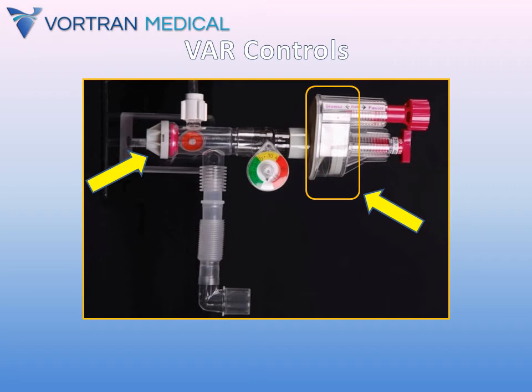Should you doubt the benefits of PEEP, take a moment and watch this video to see the benefits as they turn PEEP on and off.